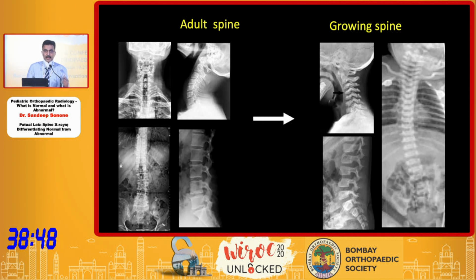As mentioned by the previous speakers, the cartilaginous end plates are quite thick. The disc and the ligamentous complex are quite stronger as compared to the bone. So all these things have to be considered before we actually go on and make a diagnosis on the X-ray.